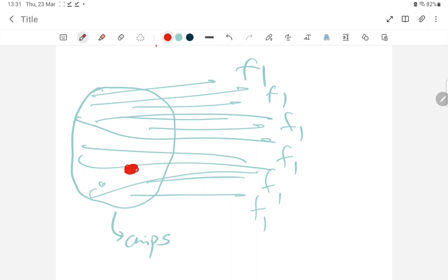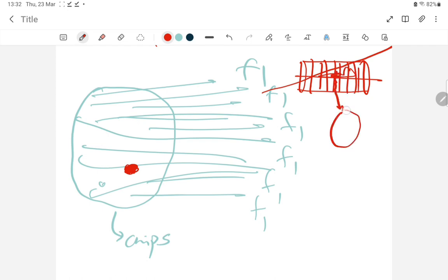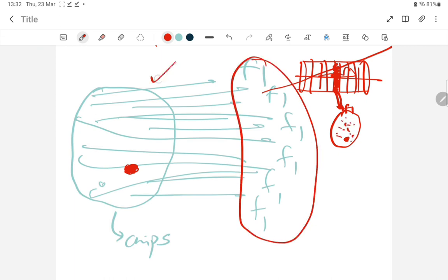That was the slice selection gradient. Here we applied one in this MRI. This was the patient. We applied one gradient and selected different slices. So your tumor was in one slice. Your slice came out. This is your slice, and this full slice is one frequency. This entire slice will give you one frequency, meaning all the points have the same frequency.